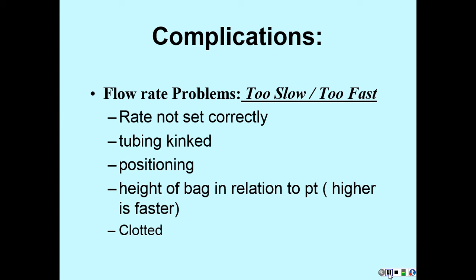Many reasons for that. And again, whose responsibility is it to monitor IV therapy? The nurse's responsibility, right? Not the PCA, not the tech. Okay, it's the licensed nurse. So when we're looking at flow rate, it may be that the pump is not set correctly. It may be that your tubing is kinked.